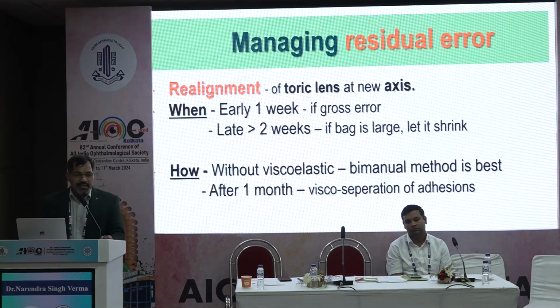So how can you realign the lens? It is preferred that you use only the bimanual IA and realign the lens. If it is more than 1 month, then visco separation is needed because there are adhesions.